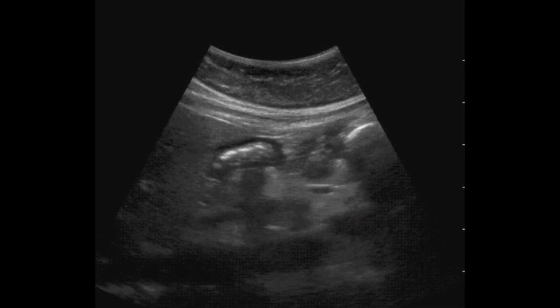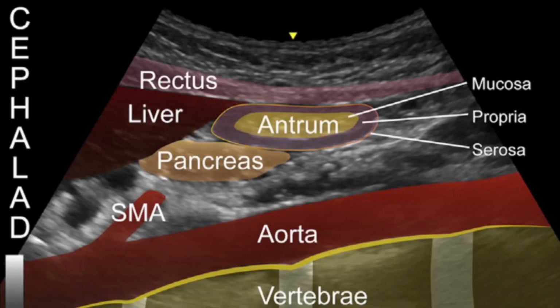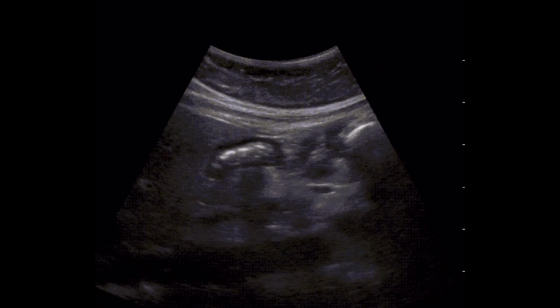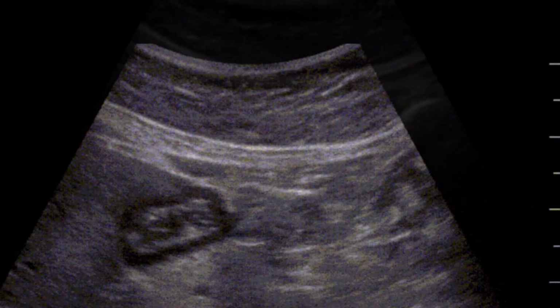Okay, so we're going to talk about the empty stomach. You'll notice a flattened oval that looks like a target. You see that dark border and the solid interior. You can see those layers of the stomach: the mucosa, the propria, and the serosa. When you squish the stomach together, it looks almost like a solid. We'll show you a couple more images here. The beam is going through. Here's an example, and another example. Pretty soon this is just all pattern recognition.